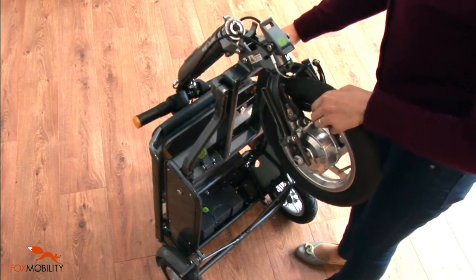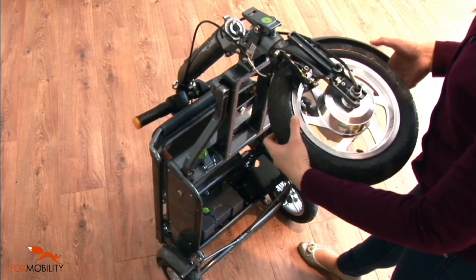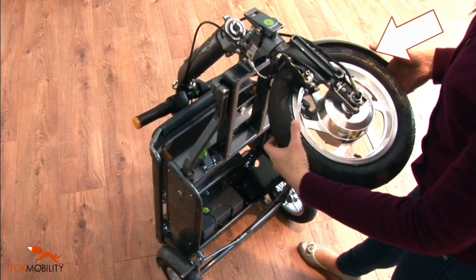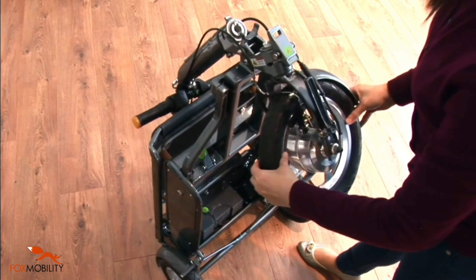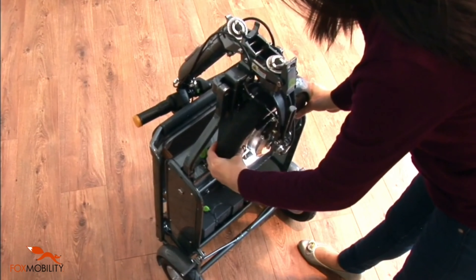Turn the front wheel so it is horizontal and pointing to the left hand side of the eFoldie, with the mudguard to the right hand side. Lower the front wheel against the frame so it locks into place via its magnetic lock.